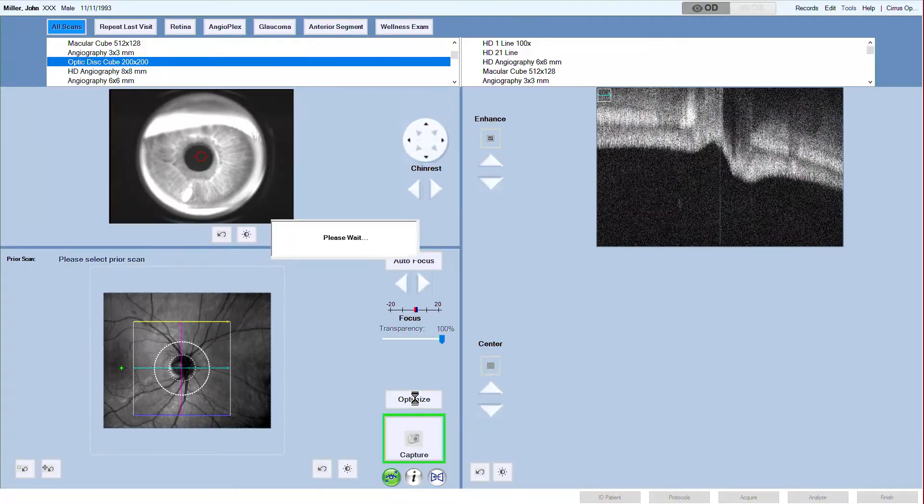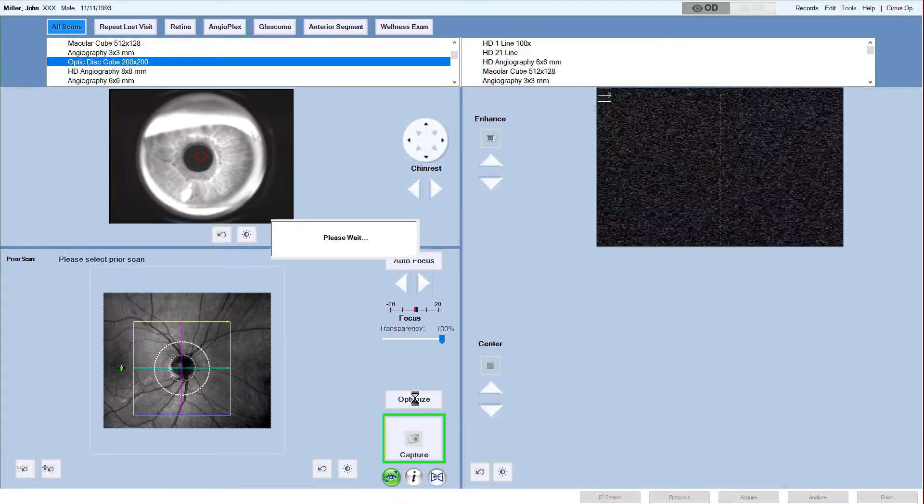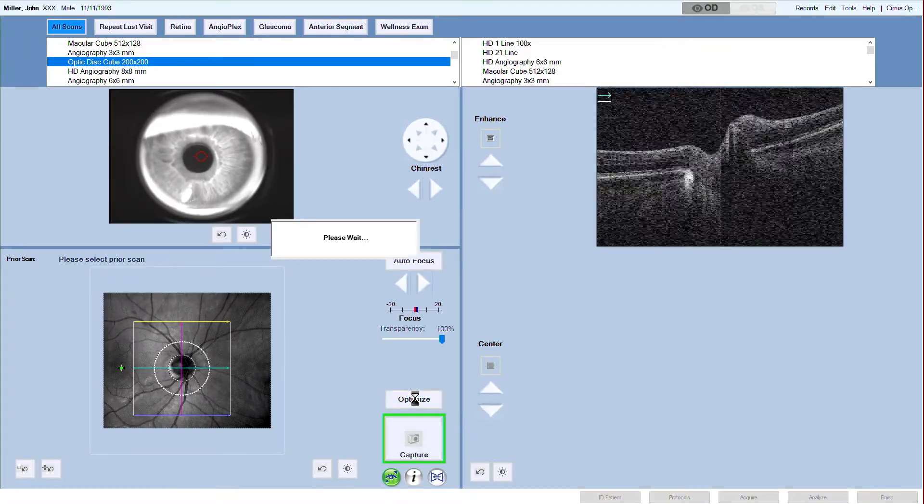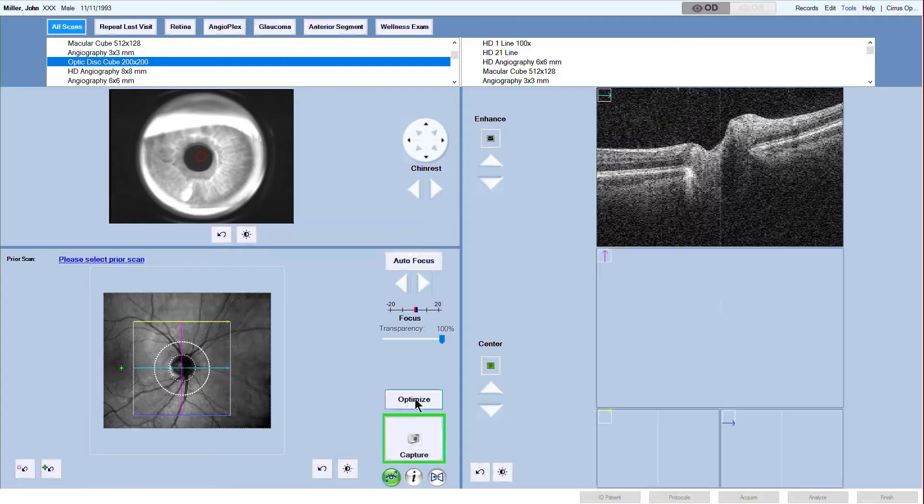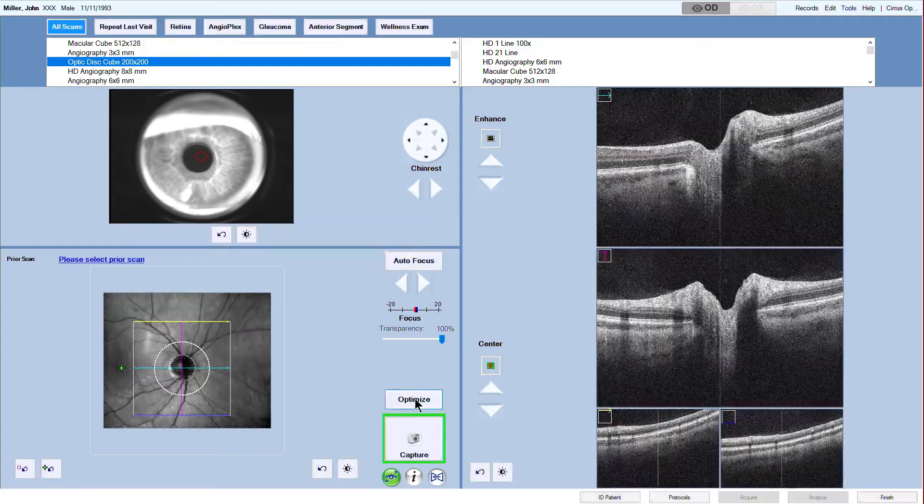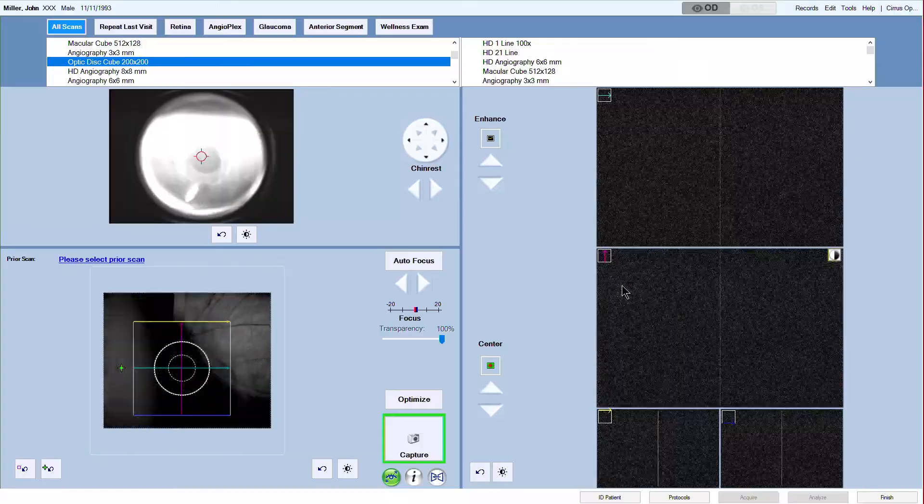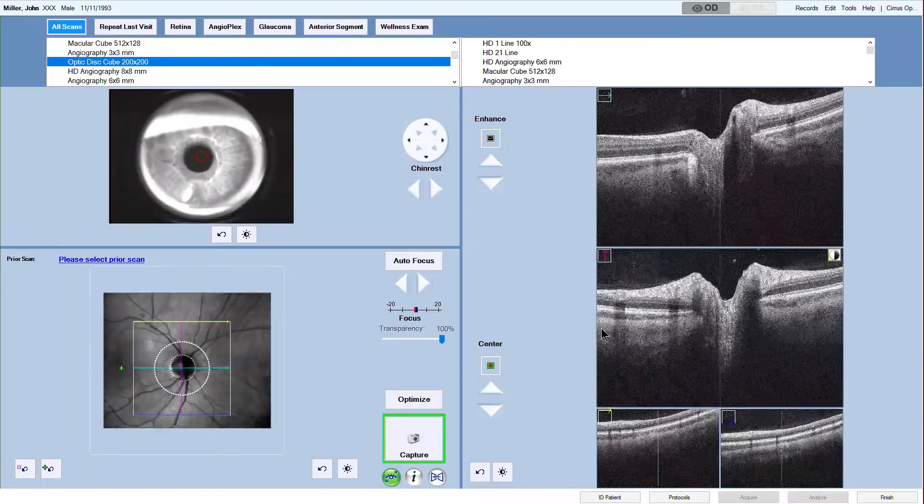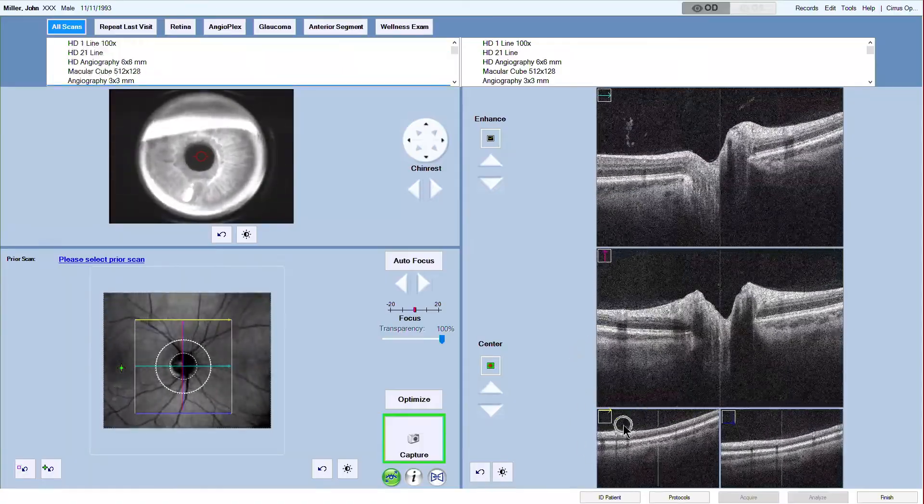For optimal signal strength, now click the optimize button. This will automatically enhance and center the OCT scan patterns. A properly aligned scan is slightly above the center in each scan window.